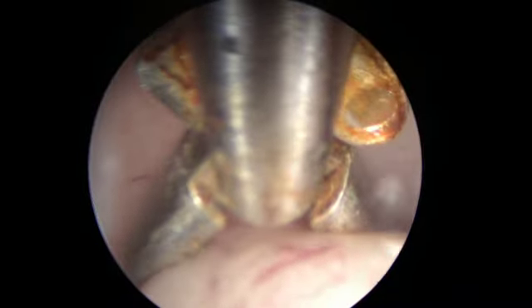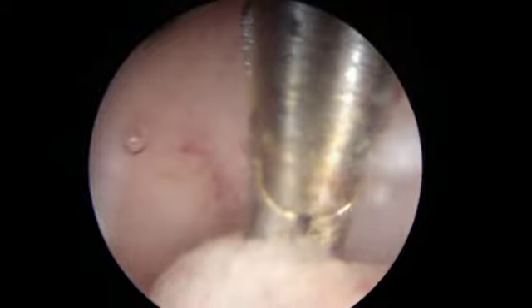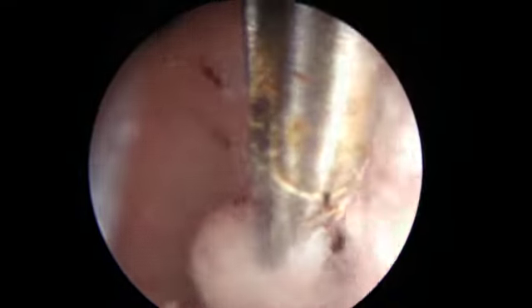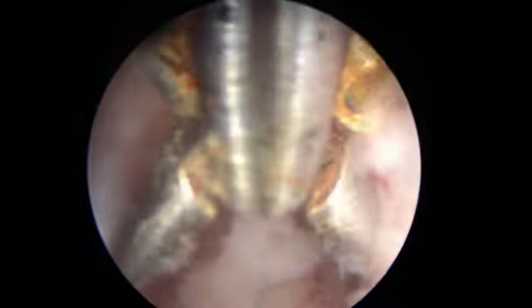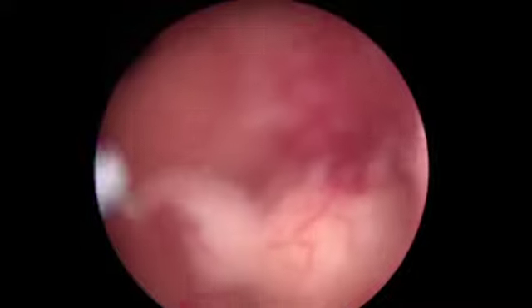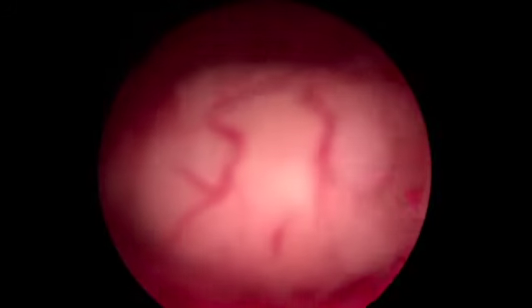We introduce the grasper, open it, and delink the polypoidal lesion from the fundus by pushing it down. It might take one or two attempts before we can really remove this polypoidal lesion. Now you can really appreciate that there are no glands on the surface, and therefore this is a nodular growth. Definitely this marks an important feature on macroscopic appearance, that this doesn't appear to be a benign lesion.